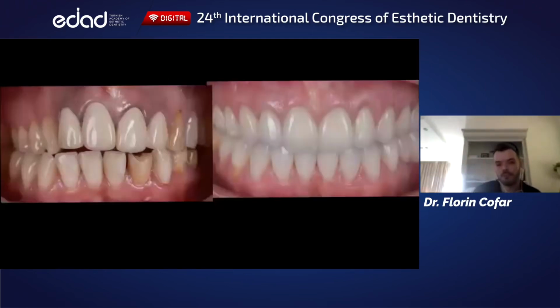So the learning points: it doesn't matter if the case is simple or complex. If there's a solid narrative in the way of using technology, it should work for both. I think that if you want to be predictable, instead of adapting the design all the time to the steps, you should always adapt the clinical steps to the design. I think using natural shapes should be a standard for everybody who's into CAD/CAM, at least in terms of mastering it.